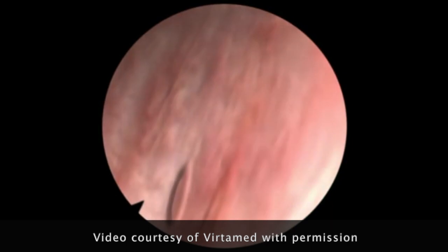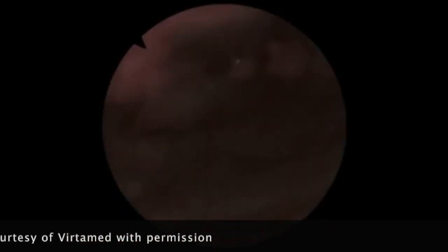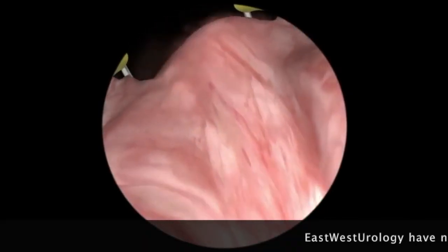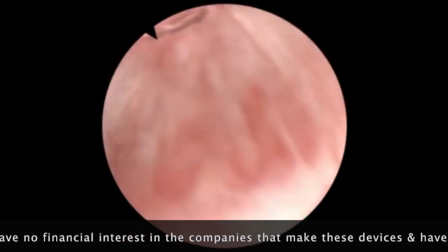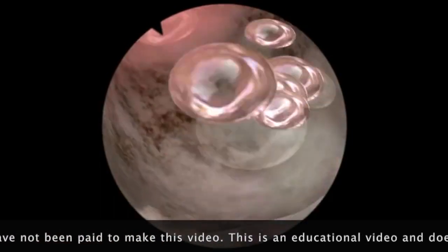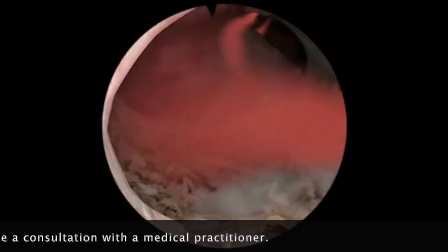The first step is to inspect the bladder and identify the holes where the urine enters the bladder from the left and right kidneys. The operation involves taking loops of prostate tissue so that the prostate cavity is cut away from the inside.